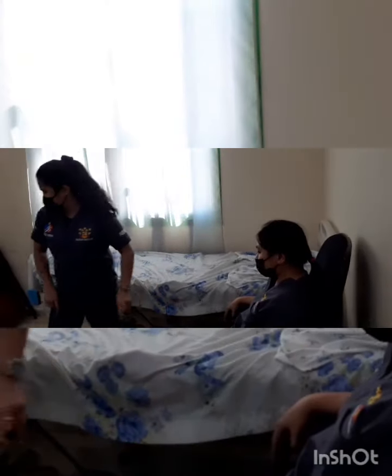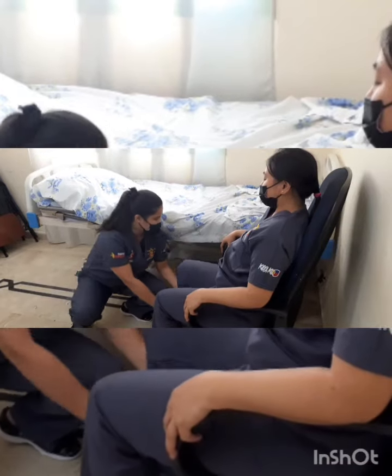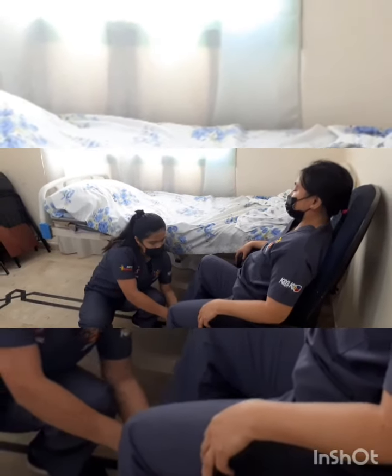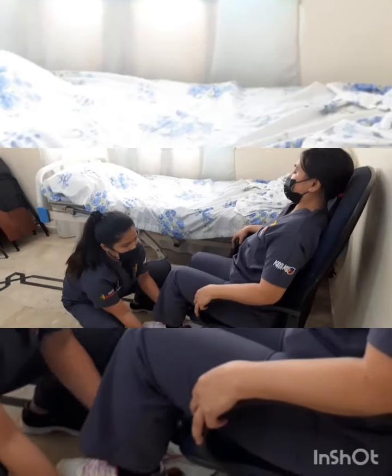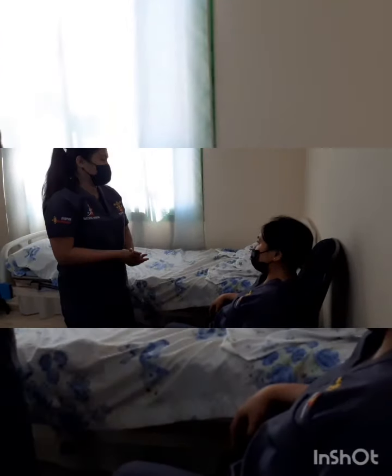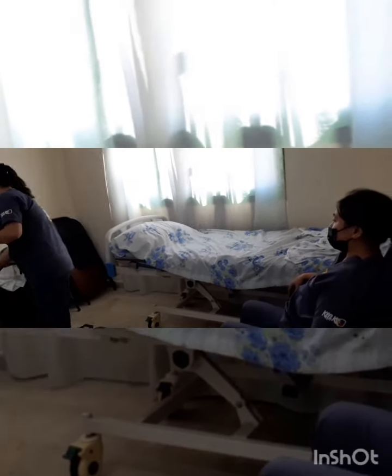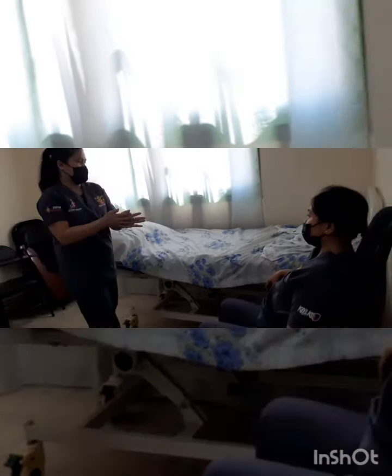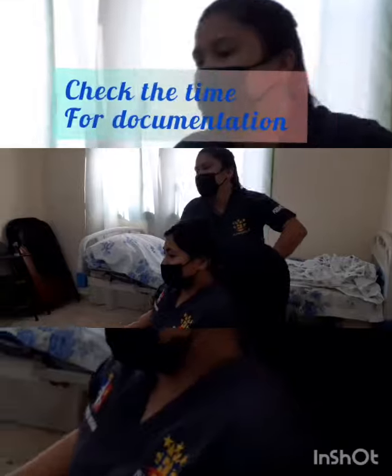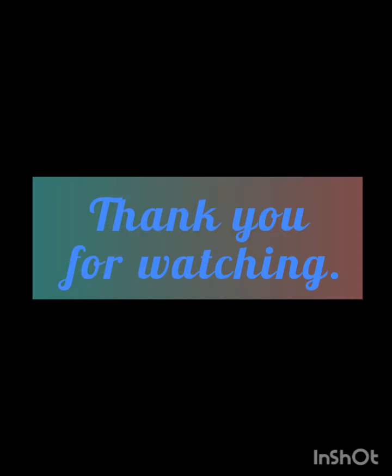I will put your shoes. Yes, some shoes — thank you. And the footplate — please put the footplate. Okay, Mrs. Ray, are you okay with your seating? Just wait, I will wash my hands again. Okay, we will go to the park now. Thank you. Okay, good. Make sure to pay attention to the edges around that.